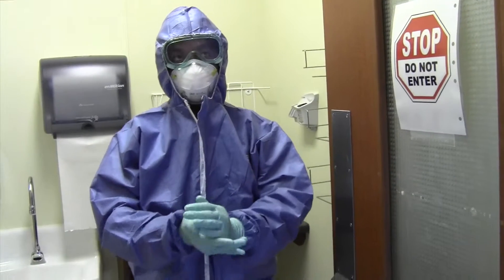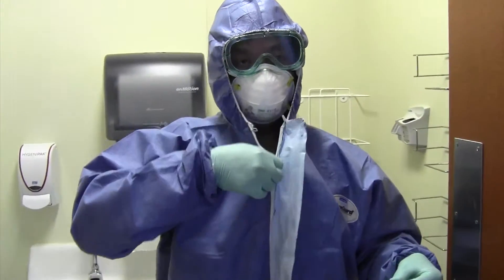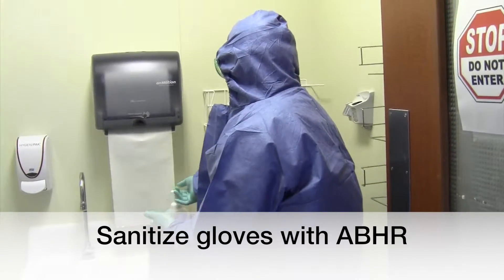Step 7: Unzip coverall from top to bottom. Sanitize gloves with alcohol-based hand rub.